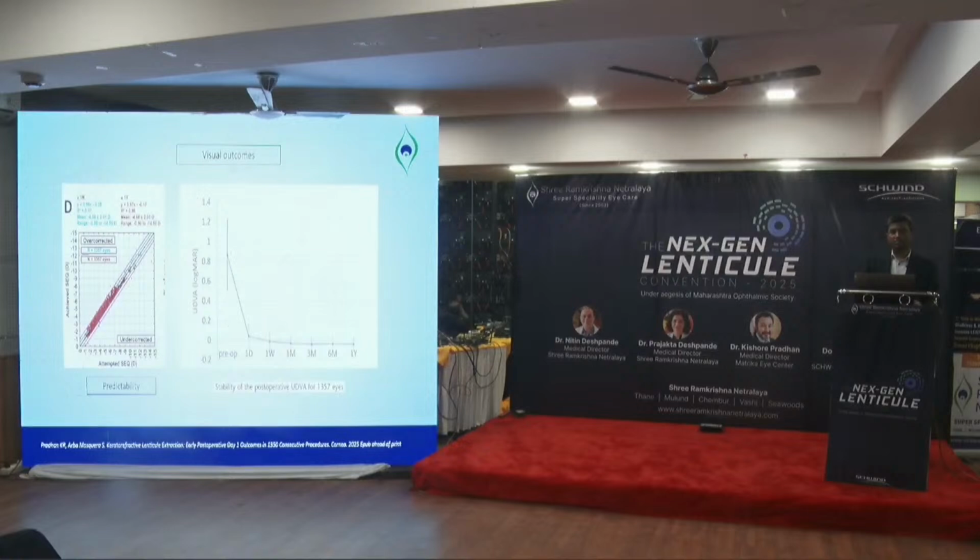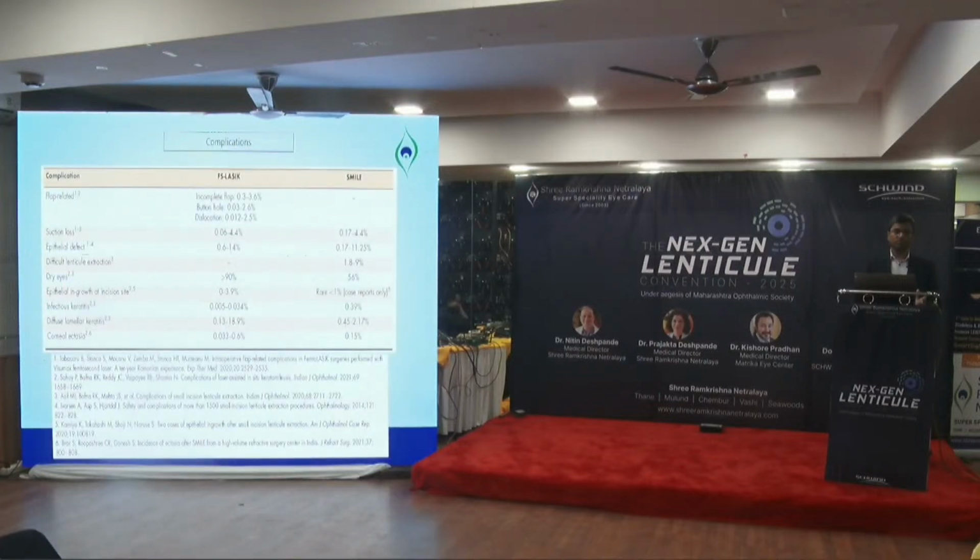How is the refractive stability after the vision correction with the Schwind device? Over a period of time, if we see this line diagram, there is stability over a period of 1 year, not much change in refraction. So it would be better to see what the complications are.